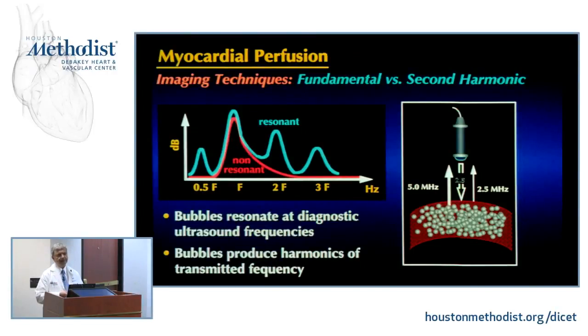I always give an example: if you hit a wire, if you're a piano player or a string guitar player, if you hit it nicely, it will give you that fundamental frequency of whatever that string is, like ping. But if you hit it very hard, you know what happens? Part of the properties of these is to emit not only the regular frequency, but multiples of that frequency.